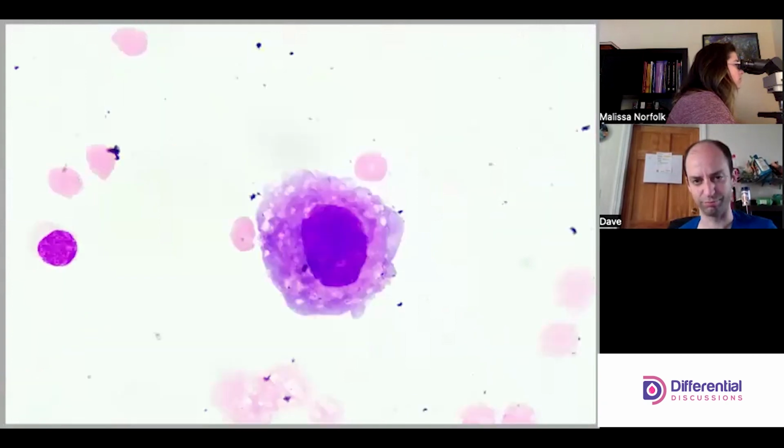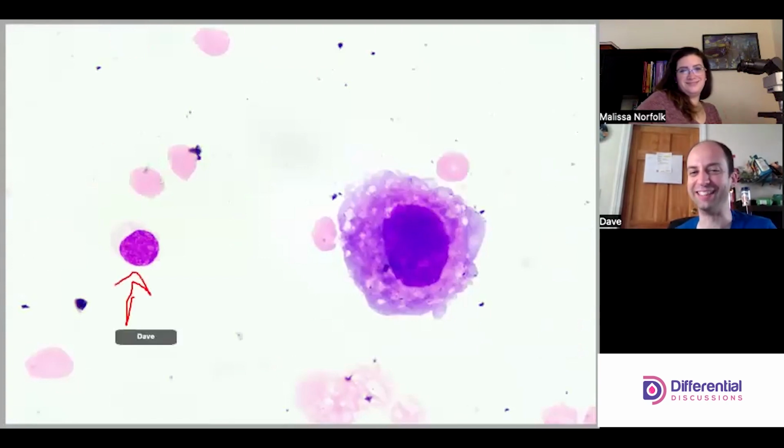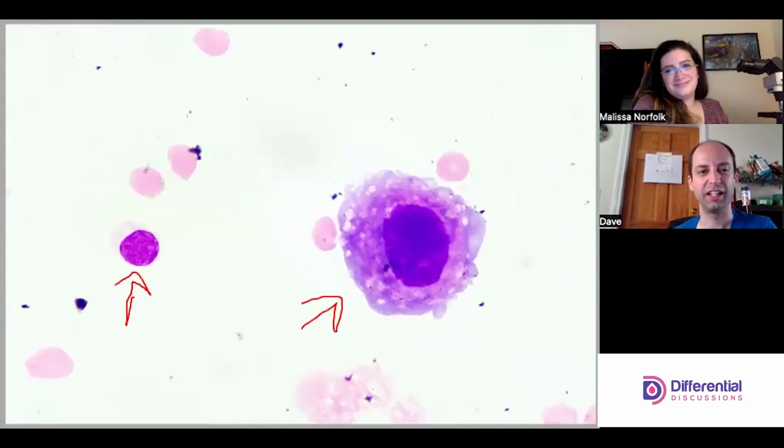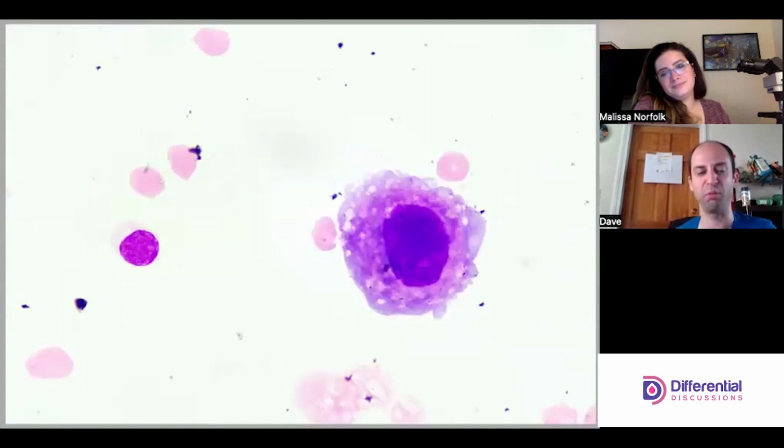So good. I love the lymph, right? If you desperately try to make more slides to make this fella on the right go away, it's futile. These red cells and this lymph are all I need. That is a totally well functioning stain. It's doing exactly what it's supposed to.